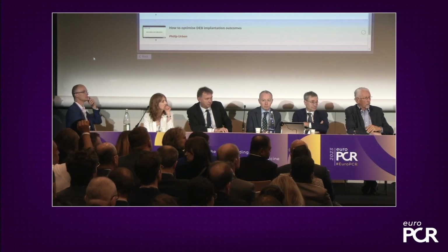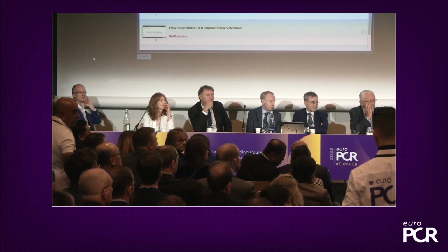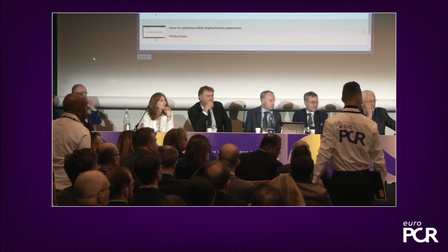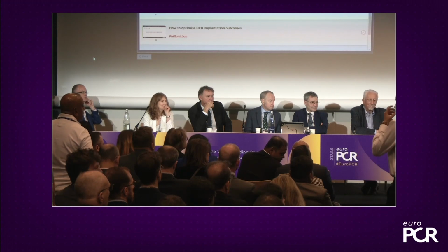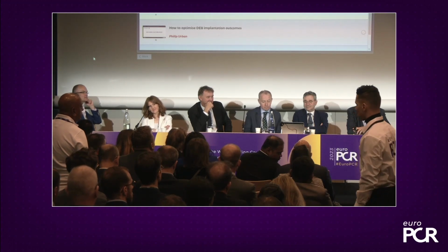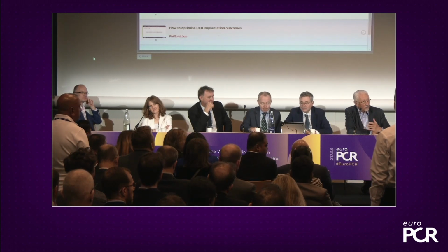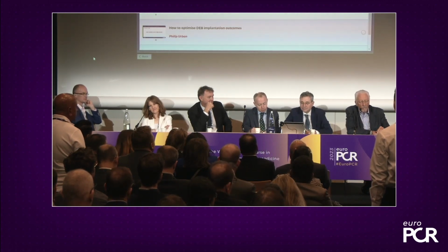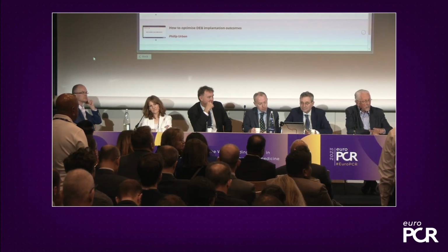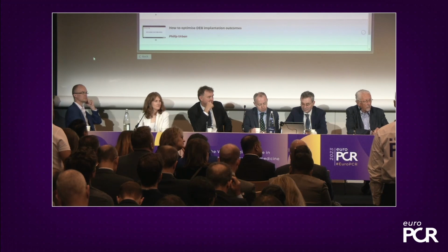Further comments? Yes, a practical question. We are going back home next week, and we have a high bleeding risk patient. Should we consider treating him with a drug-coated balloon, or should we wait until we have some more evidence? That's a very good question, and it's exactly back to Christian's statement at the end of his conclusion slide, where he says this data has the potential to profoundly modify the way we treat patients. I think there's a lot of reason to think that it's perfectly safe, but exactly what the TLR rate will be compared to stents, this is why we are doing the trial, to find out.